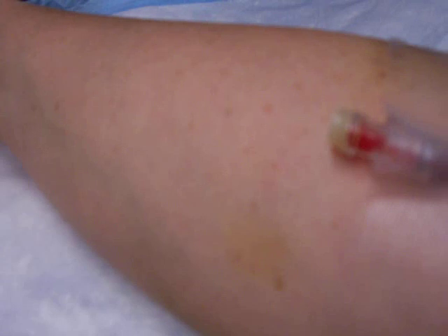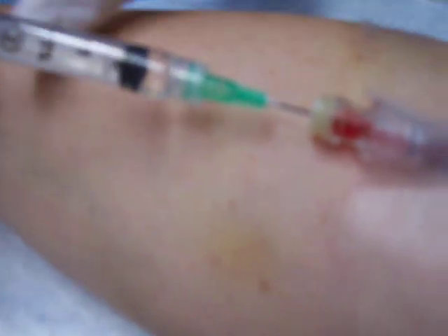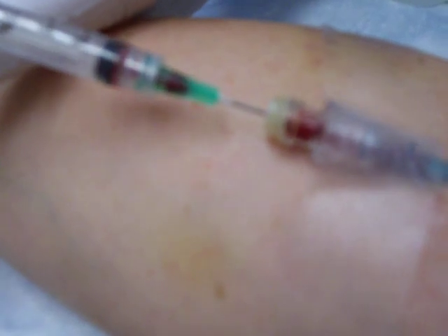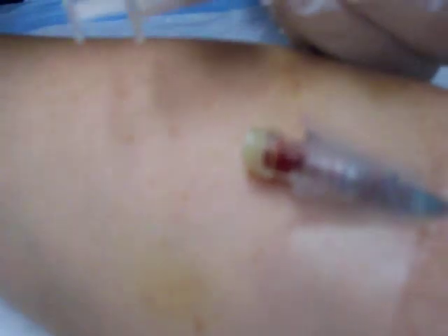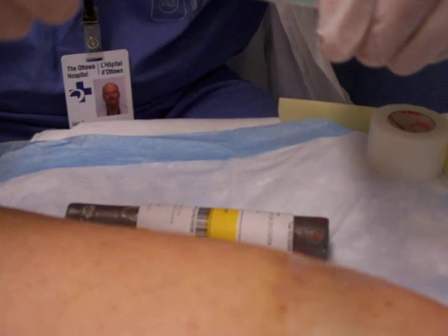And this is the actual injection here that we can just put right into the plastic tube, you see, so you don't even feel this. And even the little plastic syringe has a little label on it too, which gives us our little radioactive symbol there.